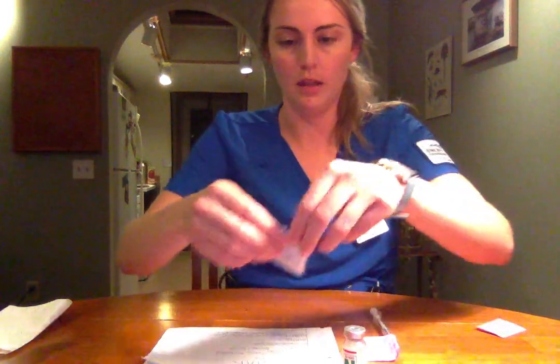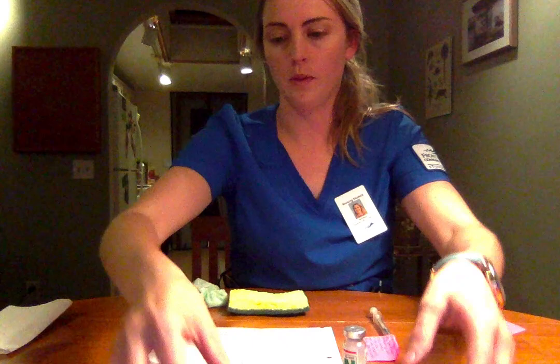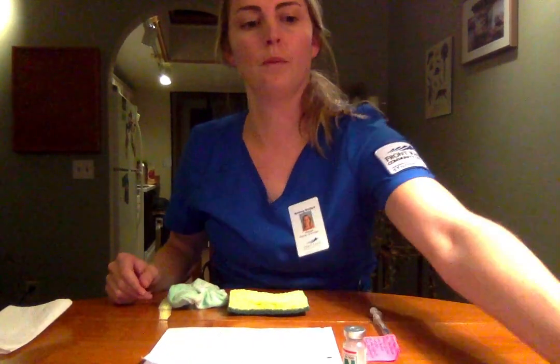Okay, now I'm going to get all my materials ready for my patient's room. So I'm bringing my MAR, my vial here, of course my syringe. I have an alcohol pad. This is my patient and the wristband. And I have gloves here. Okay, so everything is good. And I'm walking down to the patient's room.